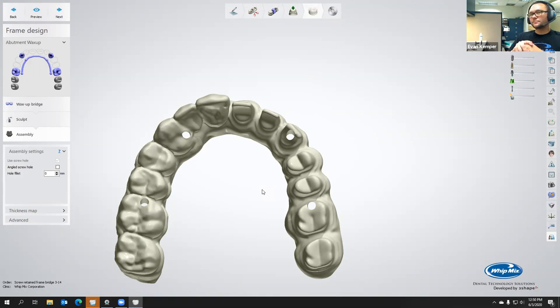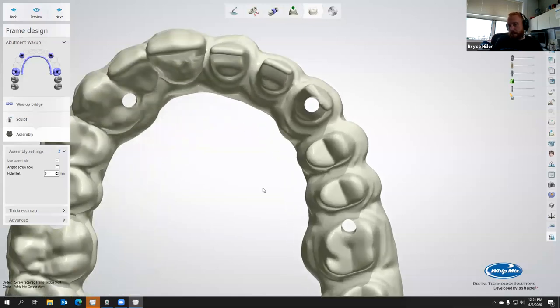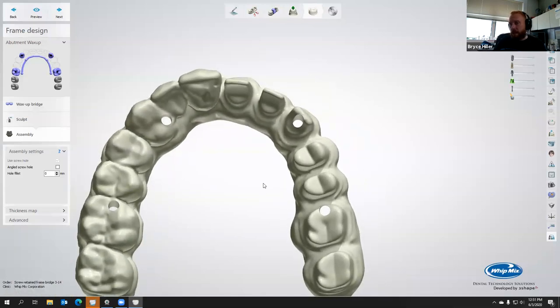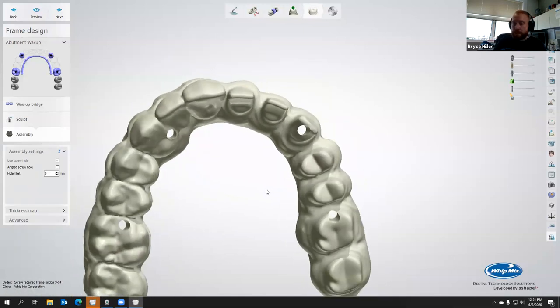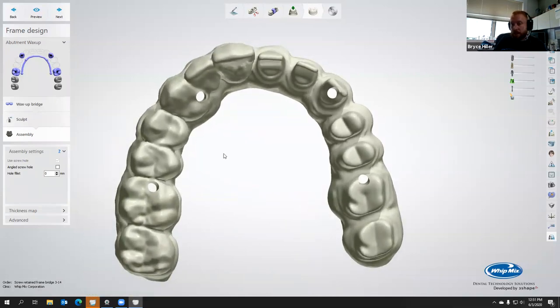So now, yeah, the way True Abutment does it is actually pretty sweet. They basically use an attachment kit. So you basically just design a bar profile for your abutment, and then you add an attachment. And it's a pretty solid system. Works really well, honestly. You have a ton of freedom this way.